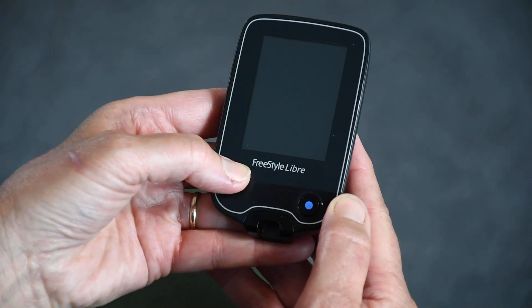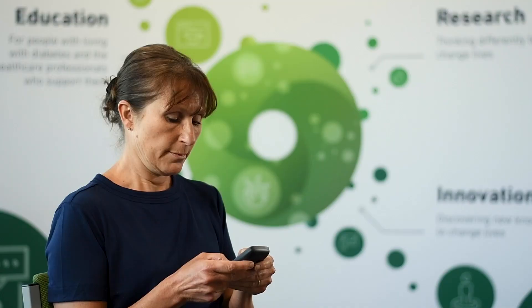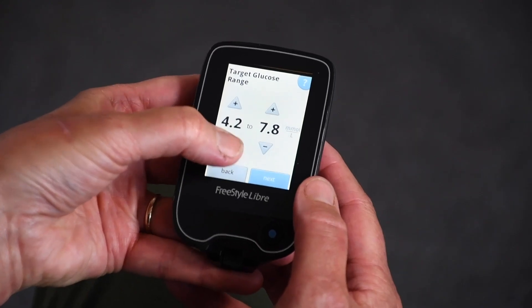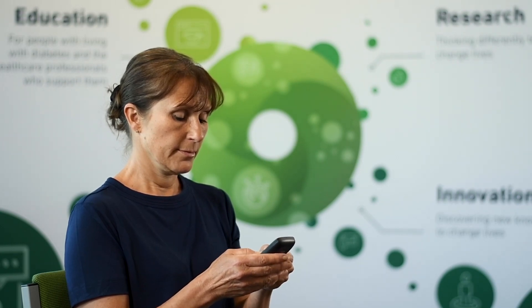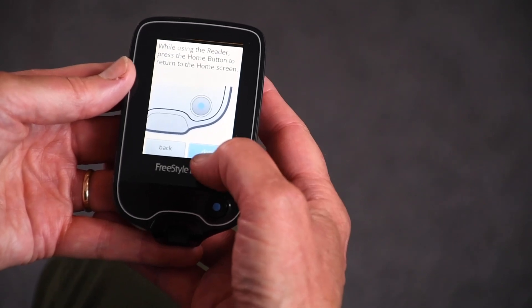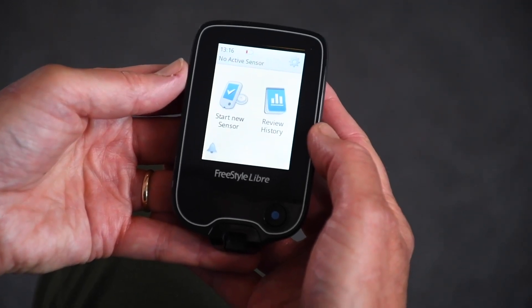To set up your reader, press the home button — the little blue button on the right hand side. You will need to set up the time, the date, and your target glucose range, which are quite clear on the screens. For the target range, set it to between 4 and 10 millimoles. You will then get to a screen which has the arrows explained — carry through that once you have read it, and it will get you to the screen where it asks you to start a new sensor or look at your history.